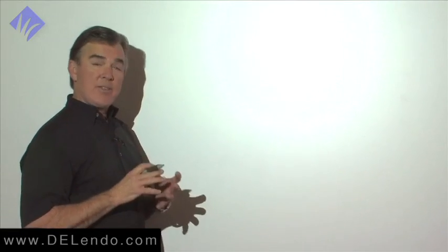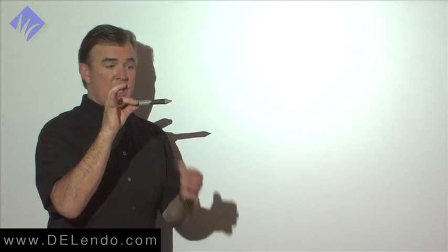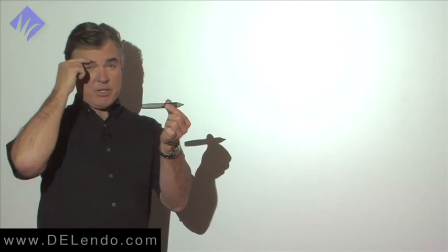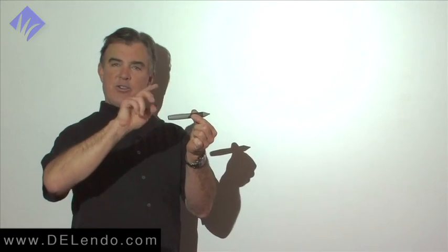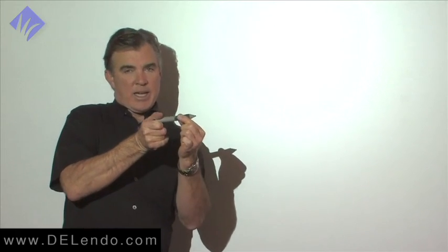Okay, so in motion, it's a complex technique. You have to get every one of these little steps perfectly. So I recommend that you learn it step by step. First, put your fingers lightly on the file, 45 to 90 degree engagement stroke with no apical pressure. Let go of the file. The engagement stroke is done. If you're a right-hander, turn your wrist this way, put the file handle on the side of your index finger, and now apply pressure and don't let go.